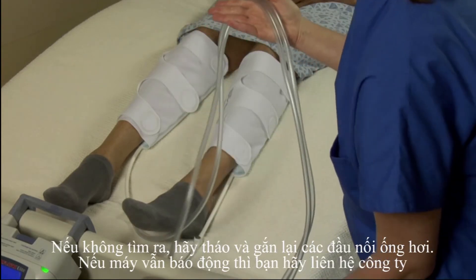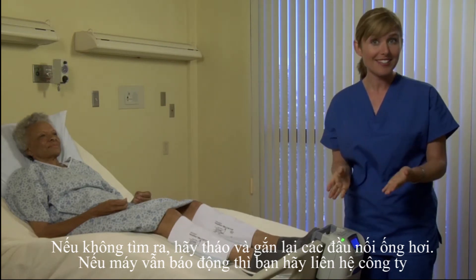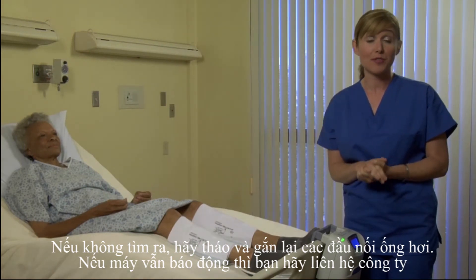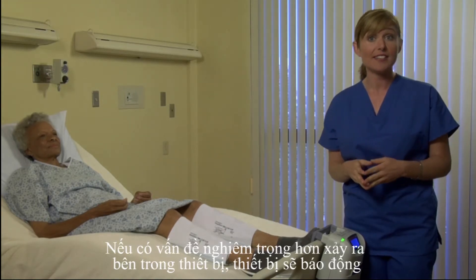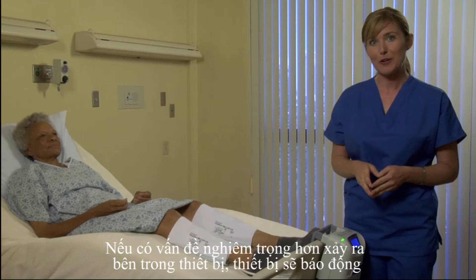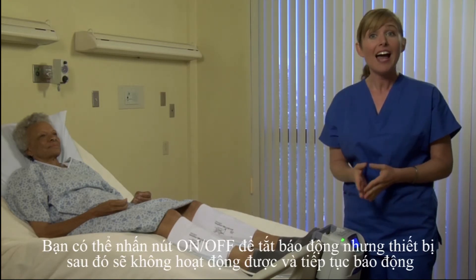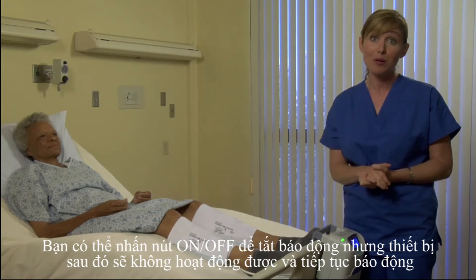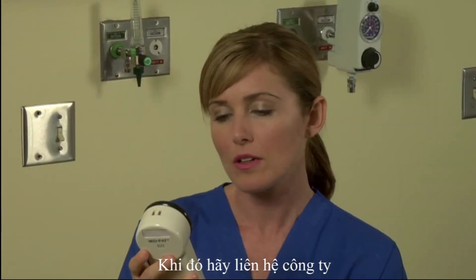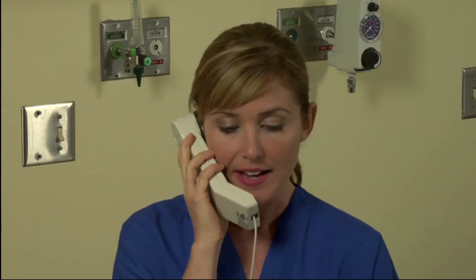If there's nothing visible, then change both the tubing and cuffs. If the check tubes alarm persists, then call DJO customer service to get a device replacement. If there is a more serious internal malfunction of the device, you may get a call for service alarm. You may press the on-off reset button to reset the alarm; however, this alarm will persist and the device will no longer function until the problem is corrected. In the unlikely event of this situation, you must call customer service to return the system and to get a replacement.